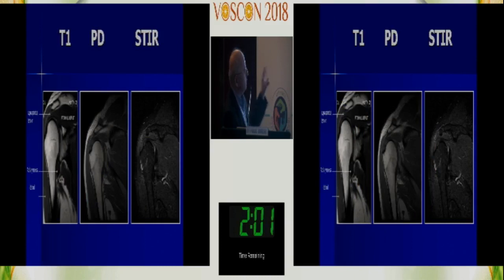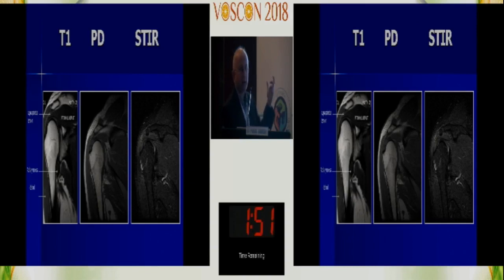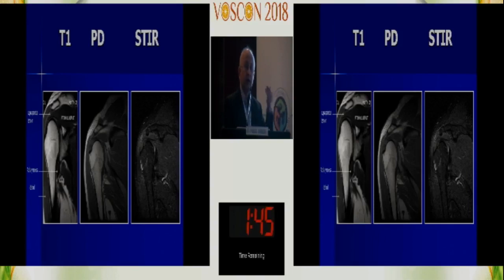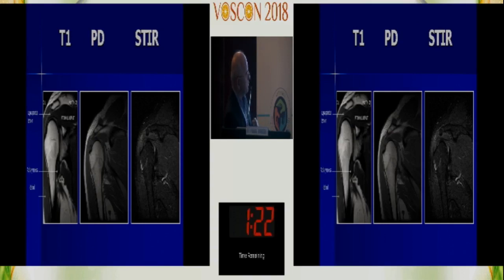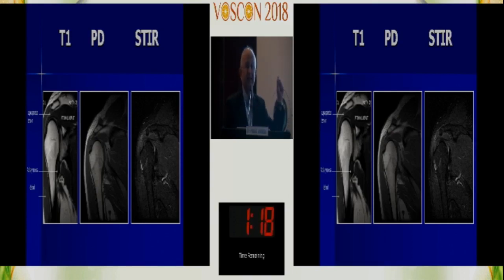Looking at three images side by side: on T1, marrow is bright; on proton density it's somewhere in between; and this is the STIR image. The MRI team is reading color shades now — they're not concerned with numerical signal values because with mixed sequences the numbers can be misleading. Proton density is the best film to show cartilage tissue — the cartilage is very well defined on PD. On T1, you see the marrow and bony structure but cartilage is thinned out, so PD images are most sensitive for cartilage.